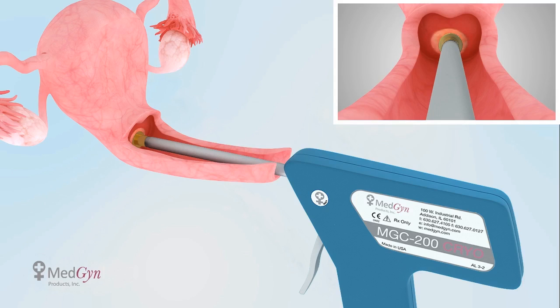To defrost, squeeze the trigger again and hold. Detach the probe once the tip is defrosted. Do not attempt to withdraw the probe prior to defrost.